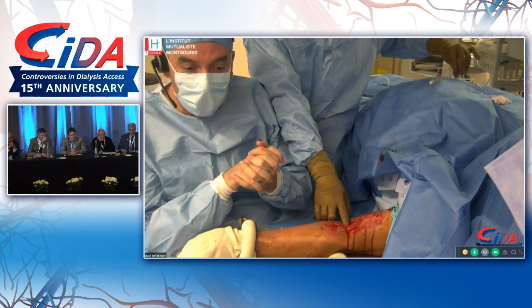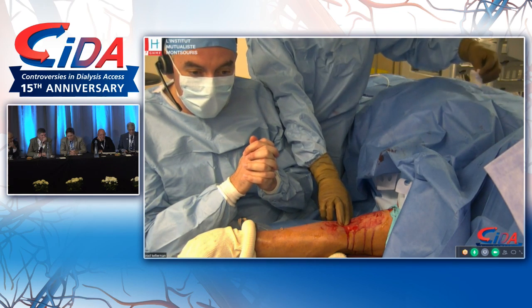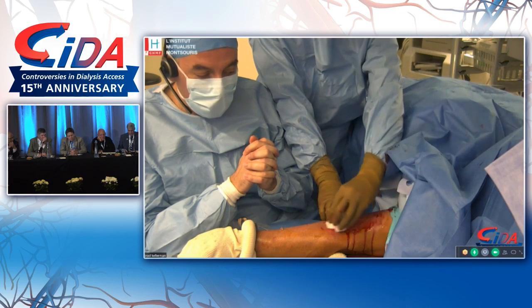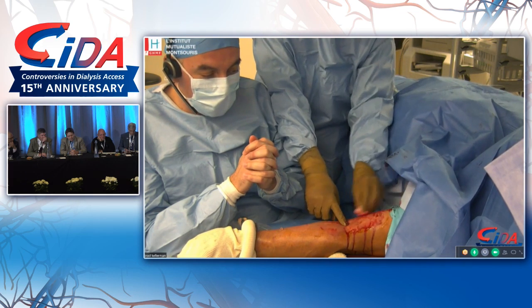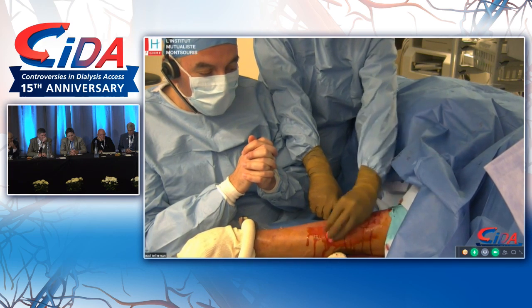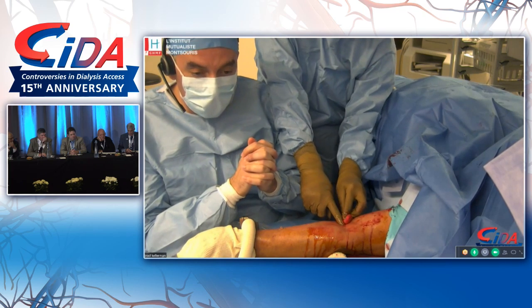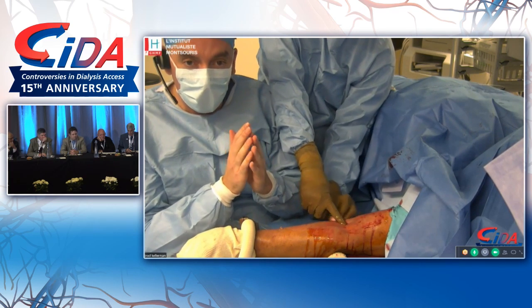Somebody wanted to ask something? Hey, Alex, it's Eric Peden. That was really spectacular. It was really awesome. Question to you is, do you ever add in embolization of the deep vein to try and encourage the flow superficially, or not needed? Okay, so I never do this. I never do this as a part of the creation.